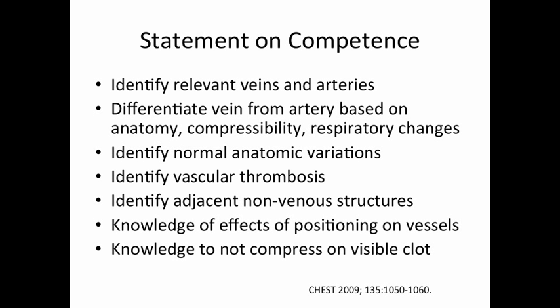You should, of course, be able to differentiate vein from artery, not only based on anatomy, but also confirm based on compressibility and respirophasic variations. You should know about normal anatomic variations. So not everybody's artery and vein are exactly positioned in the same way in everyone, and so you should be aware of that as you go forward.